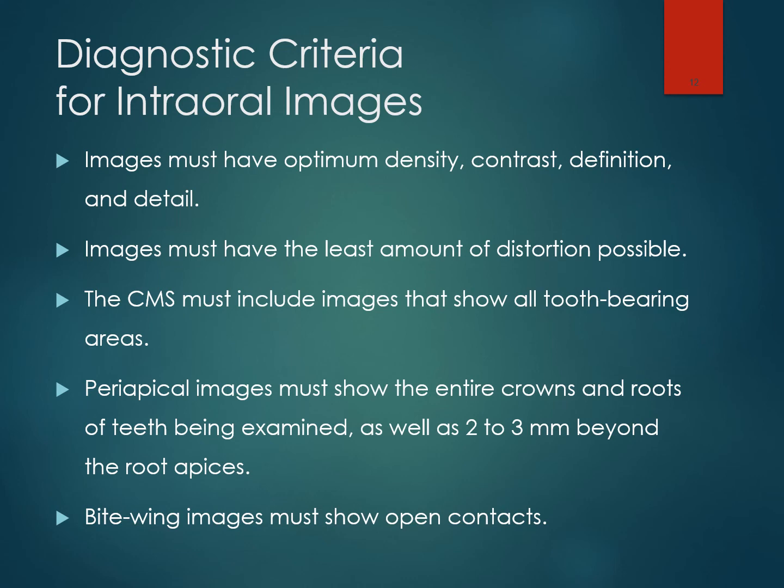And then bite wing images must show open contacts. That's not something we've discussed yet. We're going to discuss that one when we go over bite wing radiographs in class together. I'm recording this one a week ahead, so that's why. But I'll show you how to open contacts.